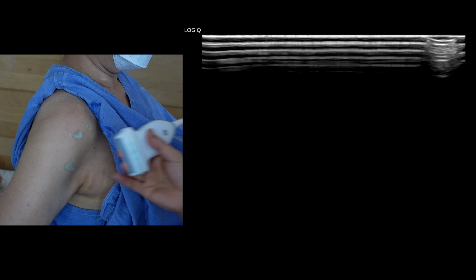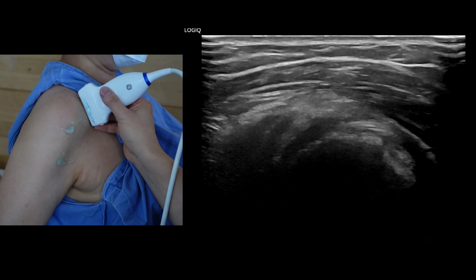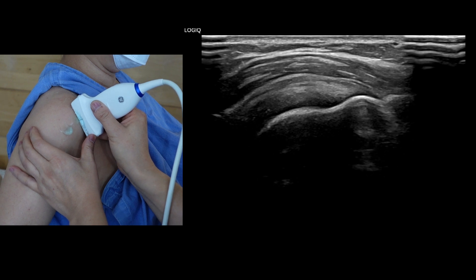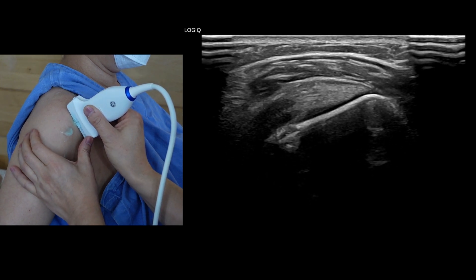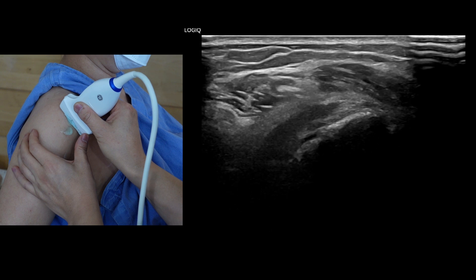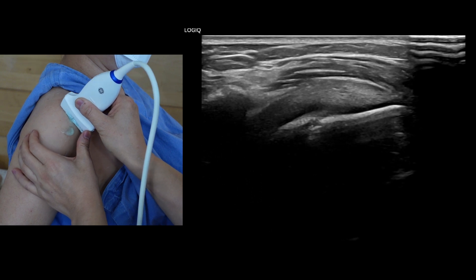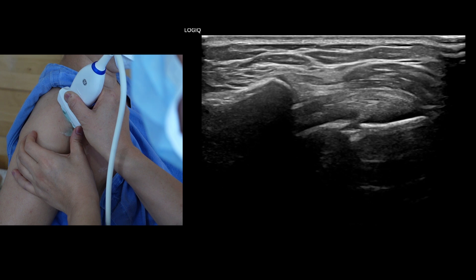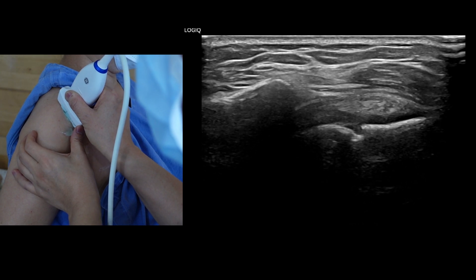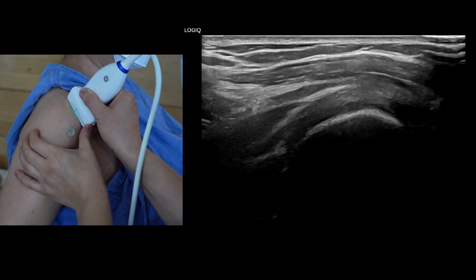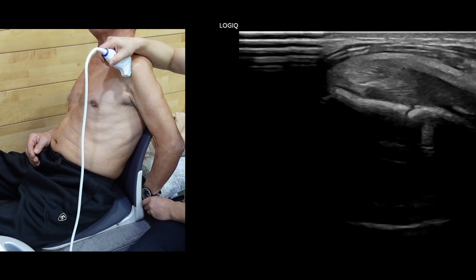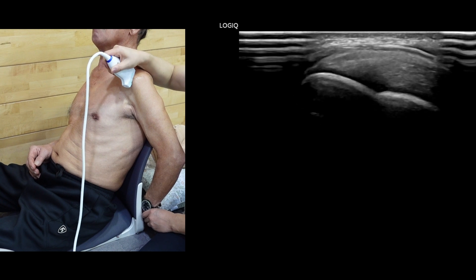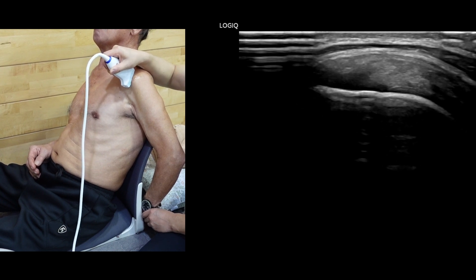To evaluate the supraspinatus tendon, position the patient's arm so the palm rests on the superior aspect of the iliac crest, with the elbow flexed and pointing backward. When you want to find fine pathology of the far anterior supraspinatus tendon, do not internally rotate — use extension with neutral or slightly external rotation. If you want to find fine pathology of the posterior supraspinatus tendon, use the patient's arm in internal rotation position.